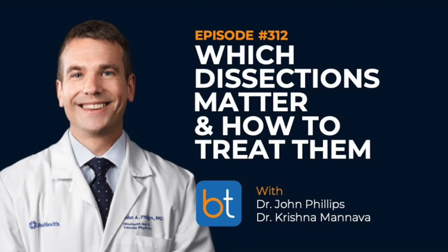Depending on the length of the dissection and where it is, I consider it, assuming it's flow limiting. For example, if we're talking fem-pop region, I've been using a fair amount of tacks across the knee joint if there's a dissection. Basically, you want to tack up the proximal and distal edges of the dissection, and then in between, I usually put a couple of tacks. You get 6 in the device for the 4 to 8s, and then the 3.5s get 6 or something like that, but we really don't use that one. The smaller ones, the tibial ones, are 1.5 to 4.5 millimeters, and you get 4 in those.